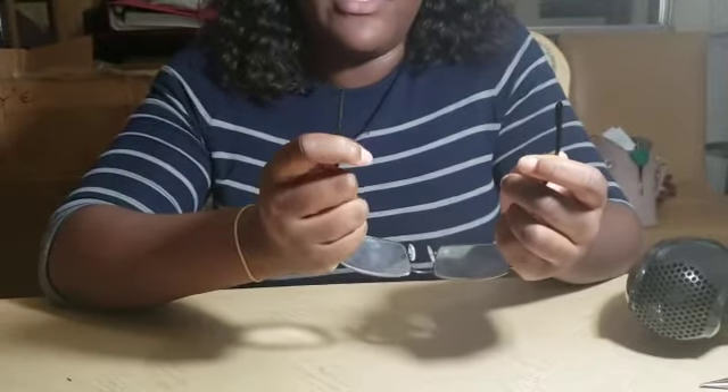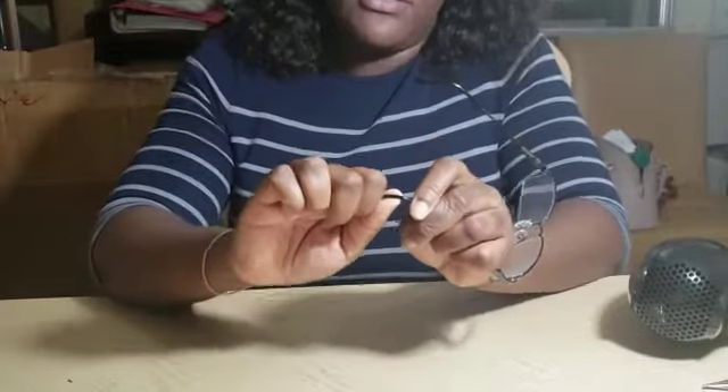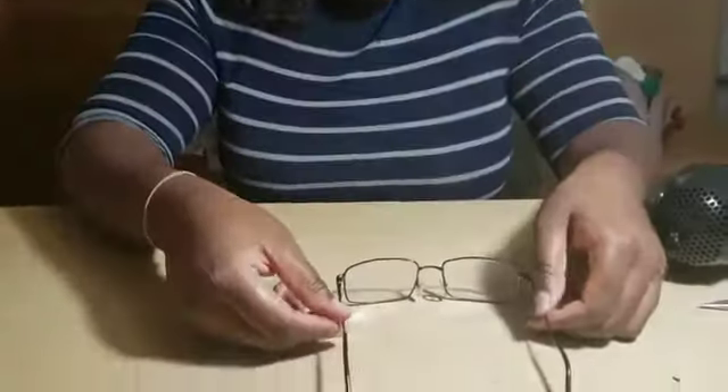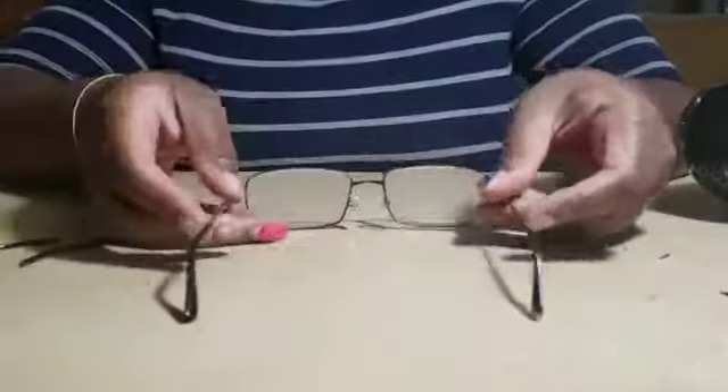We measure one of our fingers and then use our thumb to bend. Place the glasses on the table just to make sure that they look equal. And that is how we remove and insert new temple tips.